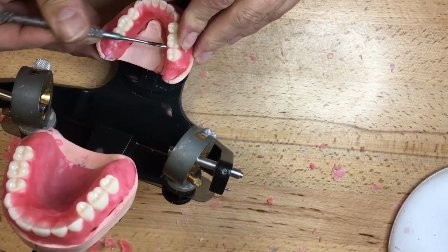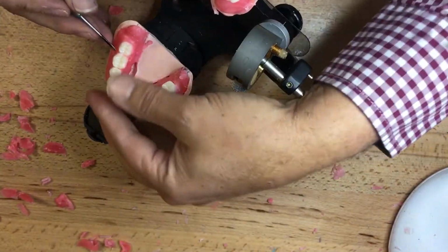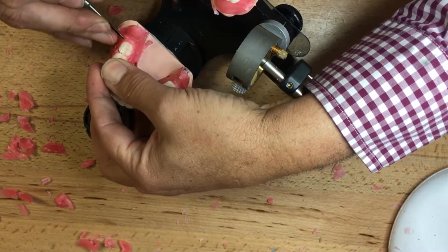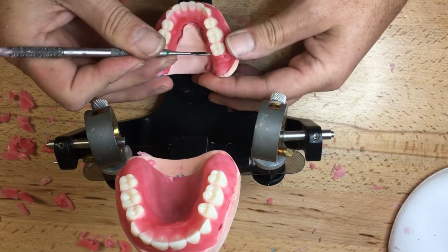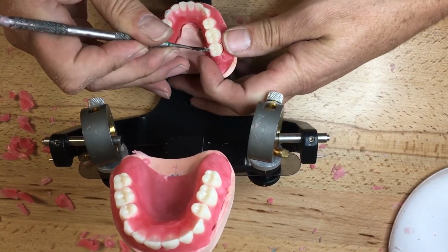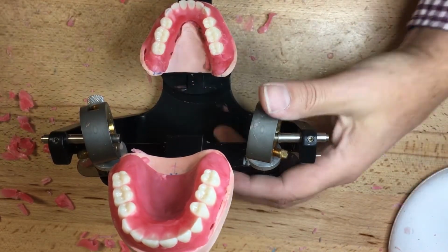At the same time. Now, if I close the articulator, obviously the teeth will hit prematurely in the posterior segment because I lifted these up. When I lift them up, I just don't stick them up. I got to keep in mind the ridge line, central groove.